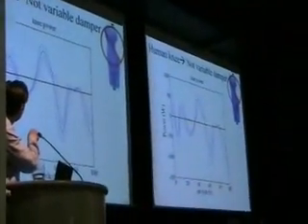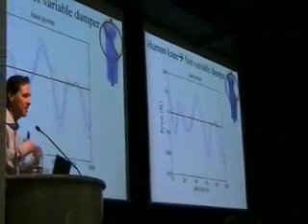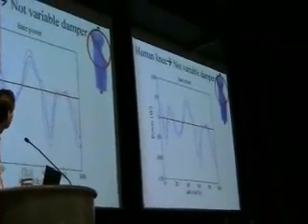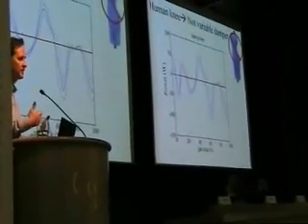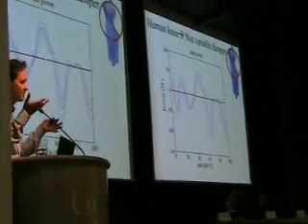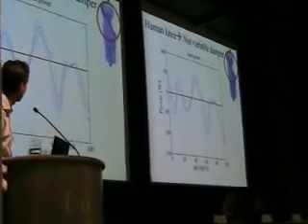And at the knee, you also see positive power regions and negative power regions. Many of the artificial knees today are only capable of applying negative power, only taking energy out of the amputee as they walk, kind of like a car brake. But the human knee, as you can see from this data, also thrusts, gives positive power. Because of these differences between the artificial leg and the biological leg, we believe, causes the increase in energy, slow walking speed, and stability problems.